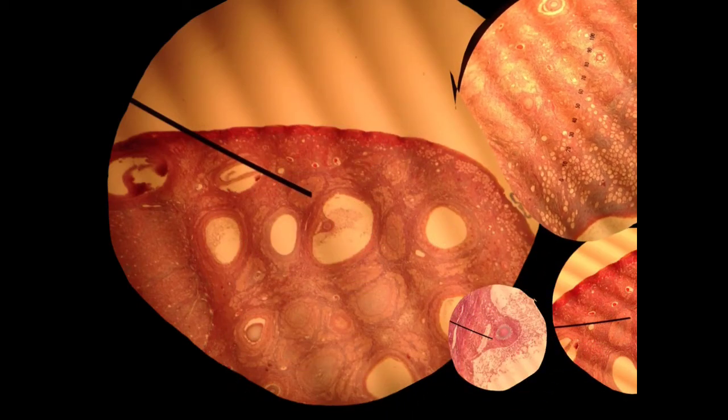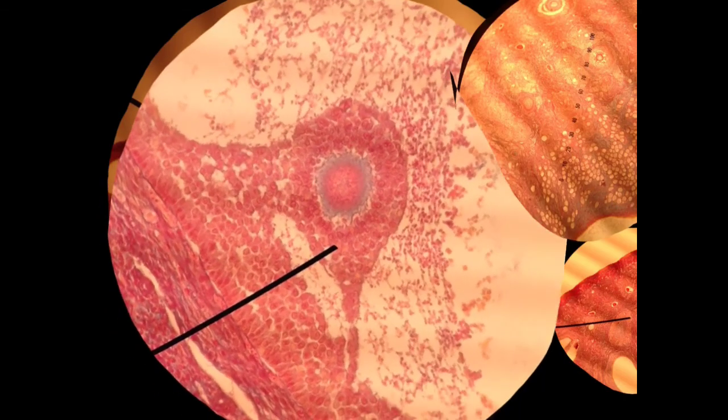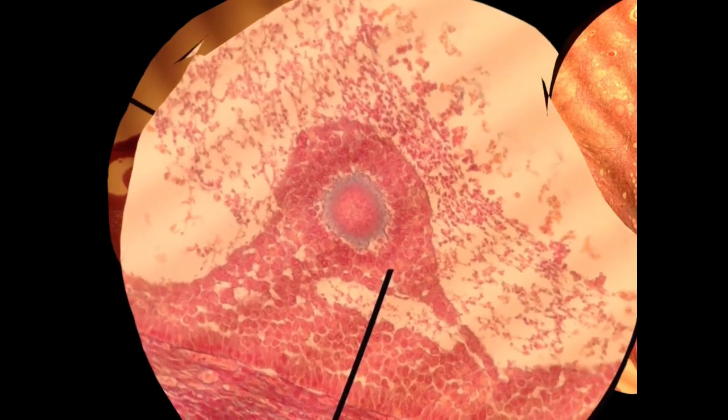Then the next stage is the Graafian follicle, which we already mentioned right here. Let's take a little bit closer look at that Graafian follicle, just so you can get a really cool up-close look at what is called the corona radiata, which are these cells right here that surround the oocyte. Again, this open space is the antrum, and around the outside are the granulosa cells.